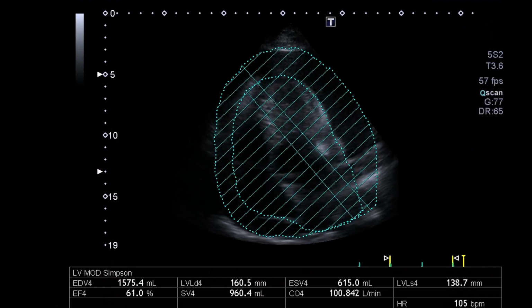What I'm going to show you now is only approximately correct, but it's fine to do it to get at least an approximation. You can try to determine the volume of the pericardial effusion. To do that, we simply did the following. We sort of had an inner sphere here and an outer sphere. You can see it down here. It's not quite right, but it's close. And then we simply traced around all the heart cavities as our inner sphere and the effusion area as our outer sphere. And if you subtract the two from each other, you can at least approximately determine the amount of effusion.